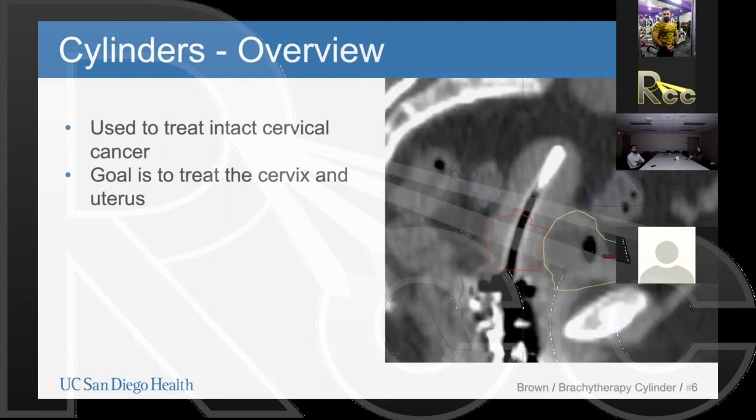So as we said previously, primarily we're using this to treat intact cervical cancer. So patients have not had a hysterectomy. We're also going to treat part of the uterus. The goal is to treat cervix and uterus.